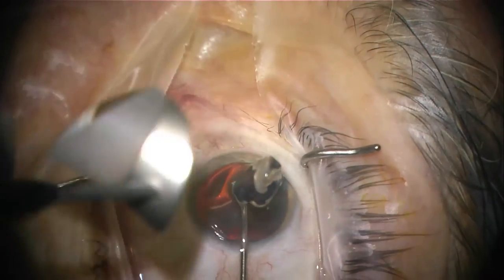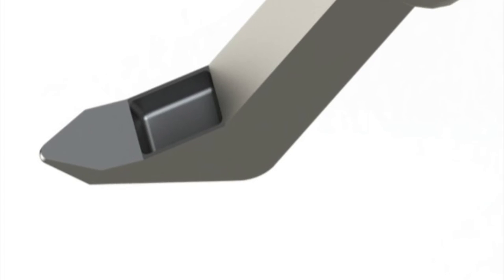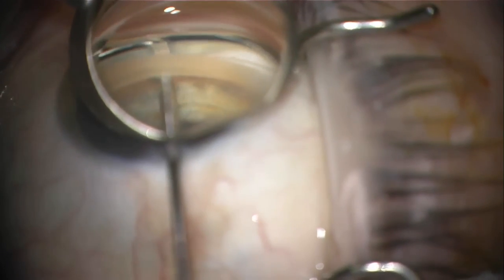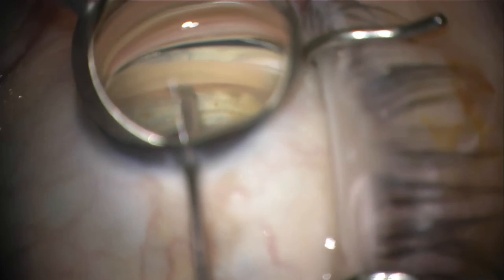The Kahuk Dual Blade is entered through the corneal incision into the anterior chamber and across to the trabecular meshwork. The tip of the Kahuk device pierces the trabecular meshwork and the blade is used to make an initial central incision of the TM.